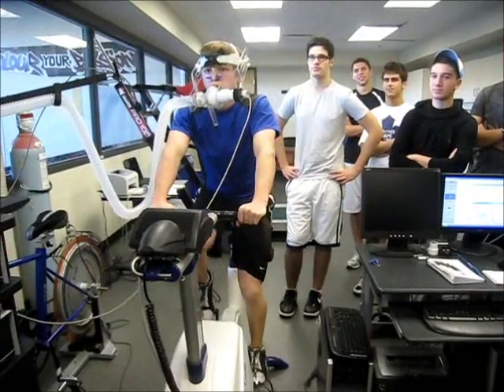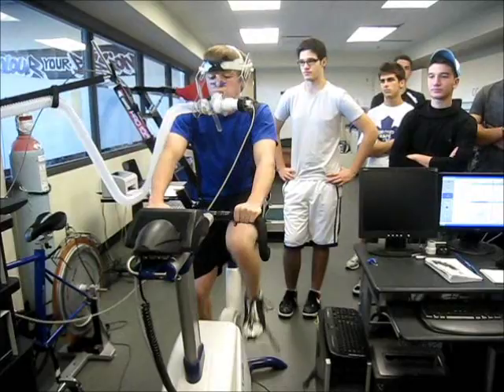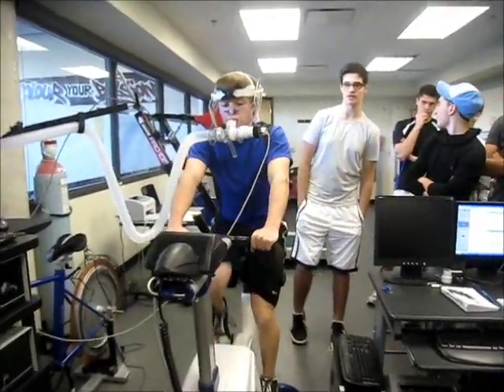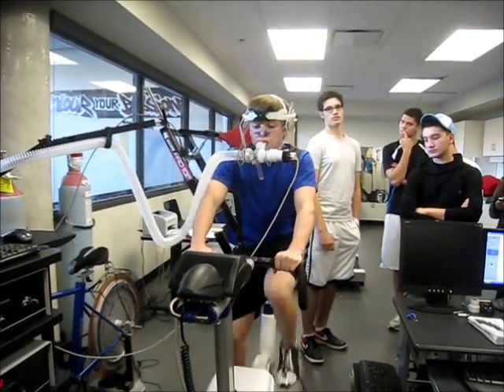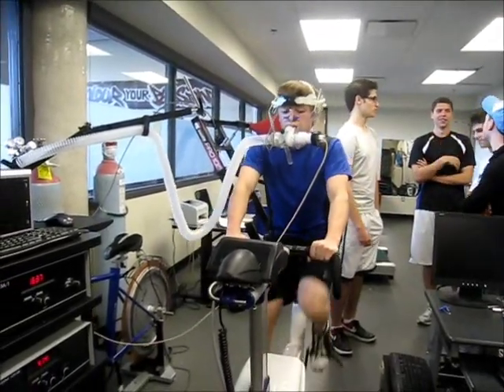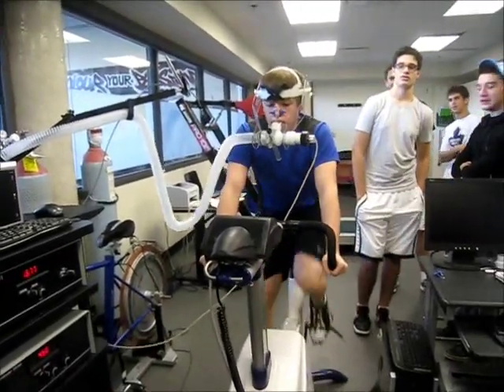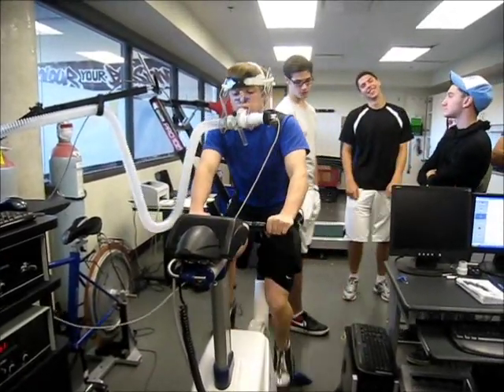Why is the protocol one watt every two seconds? Every protocol is different. Sometimes there are step protocols — like 50 watts for three minutes, 100 watts for three minutes. We find a ramp protocol is better because it gives you more information than just those level steps. There are a lot of factors behind it, but basically it's a lot easier to just do a ramp protocol. This one has been designed and validated. You can also do it on the treadmill with different protocols — increasing incline, increasing speed, or keeping incline constant. There's no single best method.